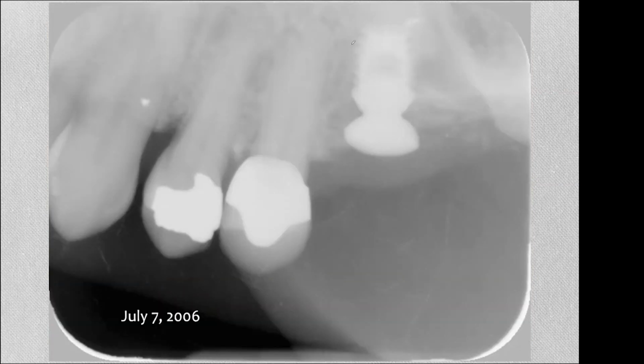And in this case, we see on the radiograph that this implant was barely touching at the very base of the shoulder on the distal, and yet it's got this almost full surface contacting on the mesial. And on the mesial, it's 2 millimeters, maybe 2.5 millimeters below the crest, and it's about 1.5 millimeters below the crest on the distal, right? So all of these are the features of the implant that we take full advantage of with the use of the SynthoGraft and the internal lift and the sinus lift abutment.